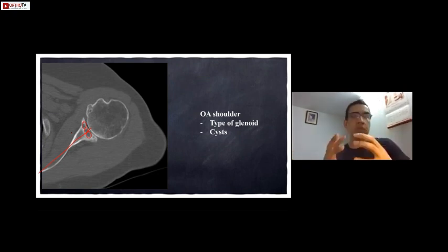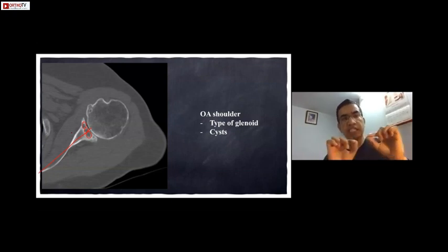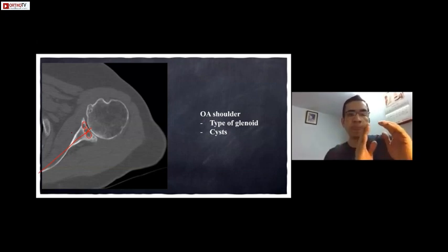it's being taught that it is the capsule which is stiff and tight, or there's a synovial thickening and all, but in fact it is the coracohumeral ligament. And Ashish has been doing some study of it where he's been injecting into the CHL ligament. So it's classically the CHL. You can actually measure the CHL thickness on an ultrasound. So if I have a soft tissue pathology in my mind, I'll go with the X-ray followed by the ultrasound.